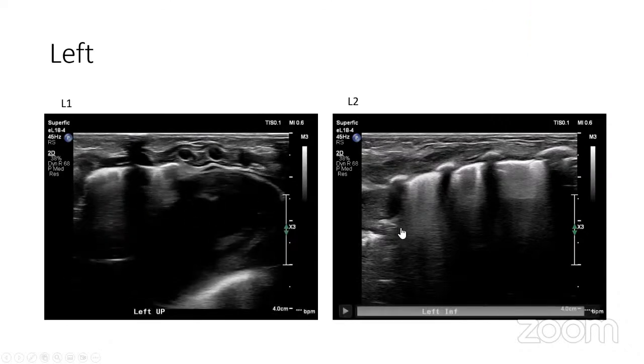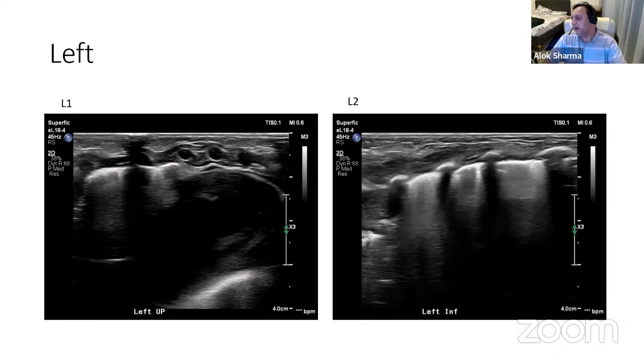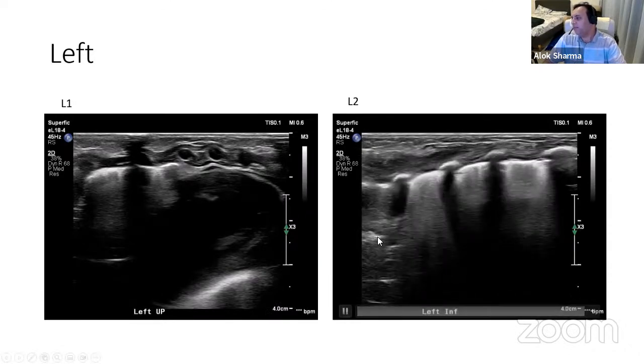Just one question about this consolidation that we see on many views. We can put the Doppler on to see the vascularity. Absolutely. And the question from my perspective is, if I'm thinking meconium aspiration in this situation as opposed to pneumonia, I would want to differentiate, and putting a Doppler on it would be absolutely fine to see whether there's vascularity or not. But it's a really nice, deep consolidation.